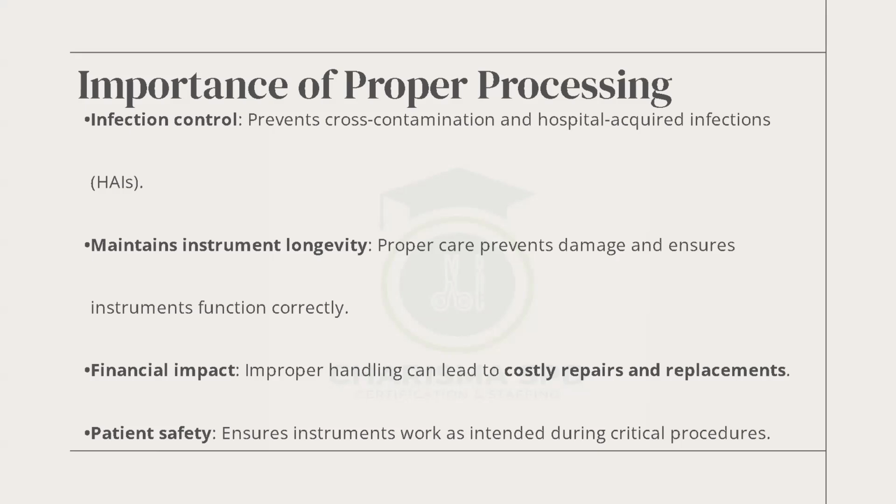So infection control is very mindful of these complex instruments. They know that cleaning them is difficult, so they are very, very curious. They want to know what goes on when a powered surgical instrument is bought. When a flexible endoscope is acquired, they want to see the IFU just so they can prevent infection in the patient.